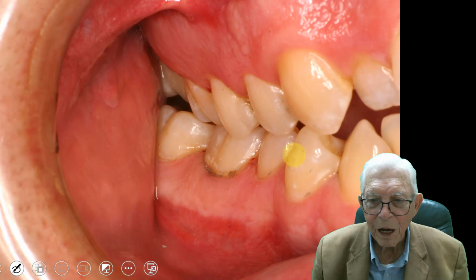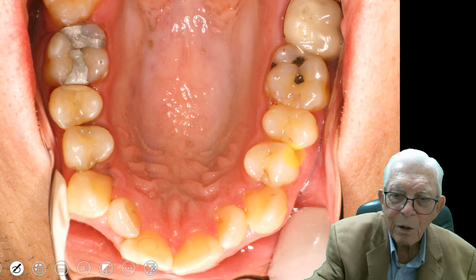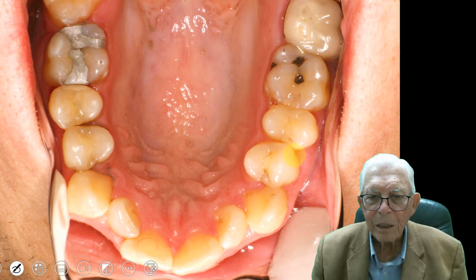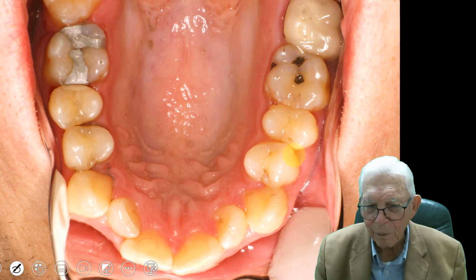All right, the other side is almost in a crossbite there. And so we're going to have to restore that kind of like it was originally. So you see how narrow the upper arch is. In other words, he's swallowing and he's pulling his lips together. The swallow problem is not developing the upper, because he's sitting there breathing through his mouth all the time.